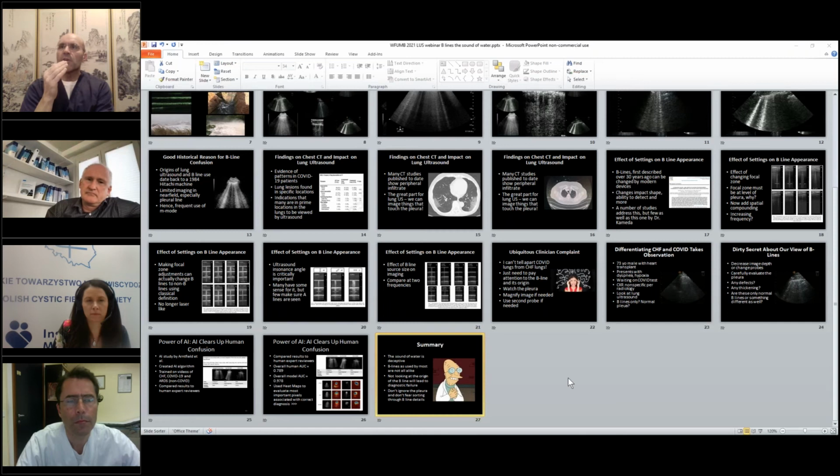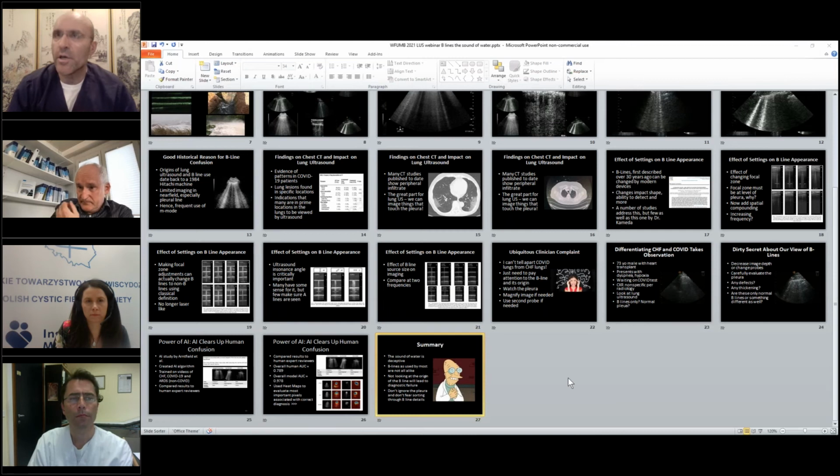When you have consultative ultrasound, although it may be necessary in many cases, it adds hours to days in delay and removes that process from the patient's bedside. So as long as skills are adequate, that physician will always do the best job. So if I could not do an adequate ultrasound for Joanna that compares to what she can do on her patient, or for Christoph. So I think it's up to the physicians themselves.